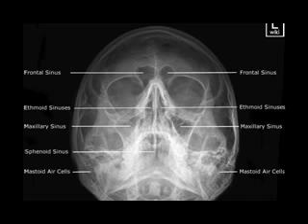Superior wall of the maxillary antrum. The superior wall of the maxillary antrum is denoted by two parallel lines equidistant on both sides, the superior line of which is the inferior rim of the orbit and the lower line is the floor of the orbit a few millimeters behind. When there is a blowout fracture of the inferior orbital wall, these two lines on one side are telescoped compared to the other, and this is suggestive of a blowout fracture of the inferior orbital wall.